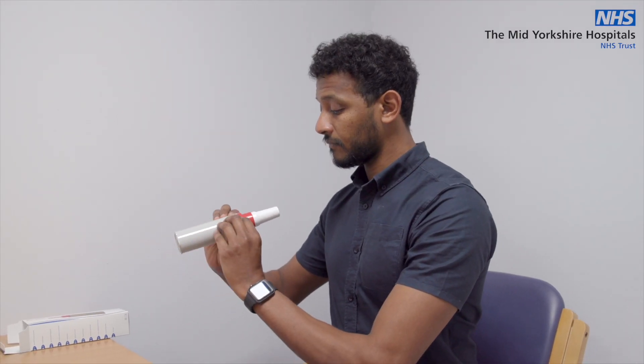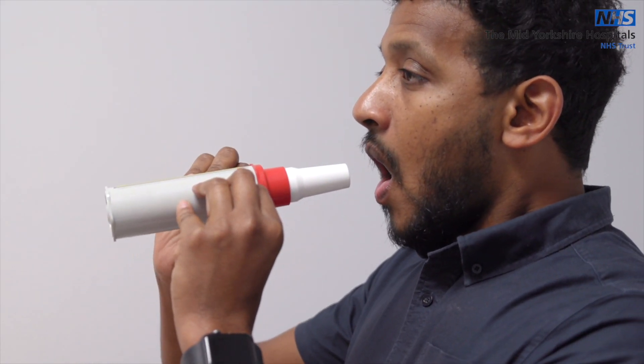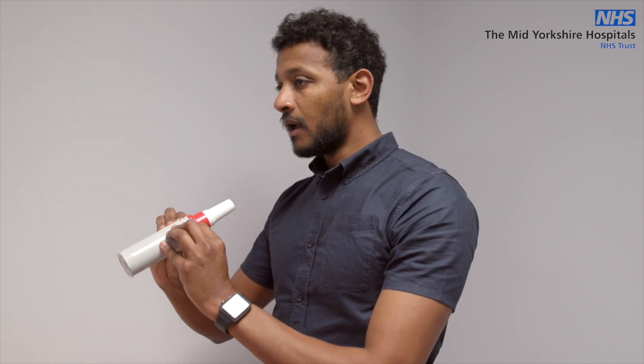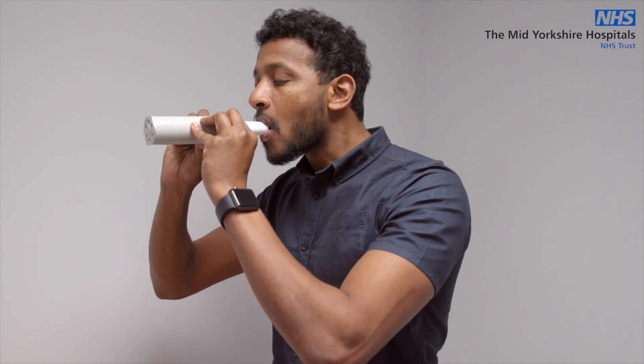Take a big deep breath in with the peak flow meter out of your mouth. When you have taken that breath in, place the peak flow meter in your mouth, making a tight seal around the end with your lips. Breathe out as hard as you can.